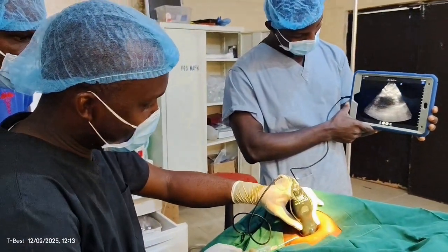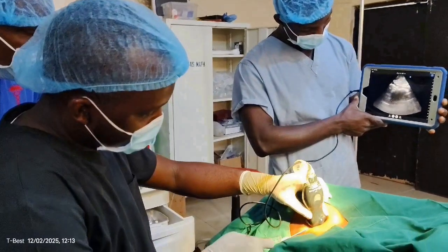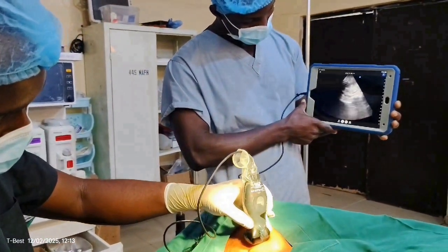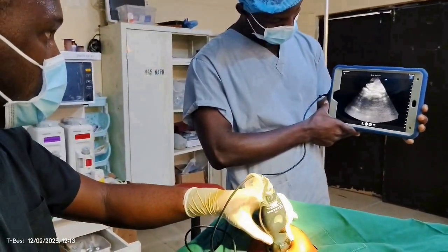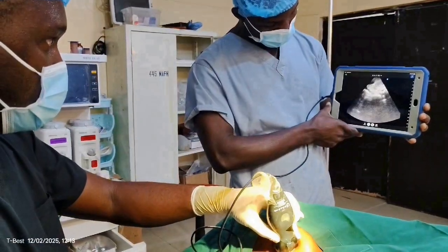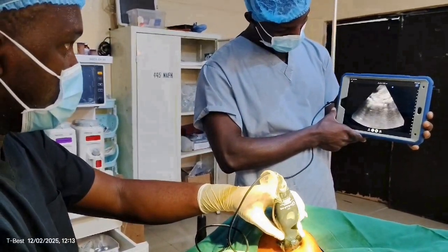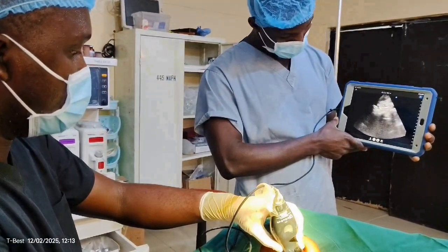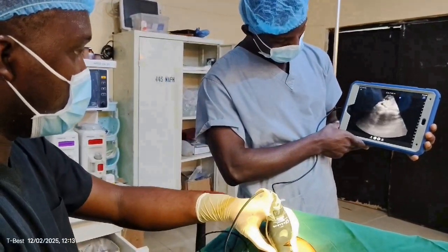Okay, so now we're going in. Midpoint with the posterior border of the sternocleidomastoid head of the mastoid. I'm going in. I'm trying to find a plane there.